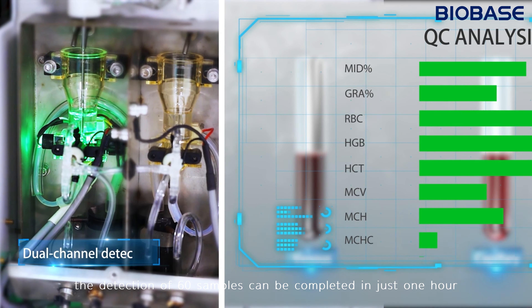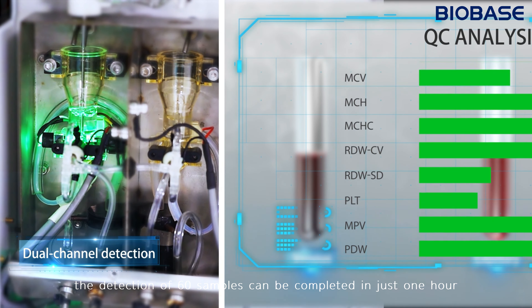Due to the dual channel detection, the detection of 60 samples can be completed in just one hour.